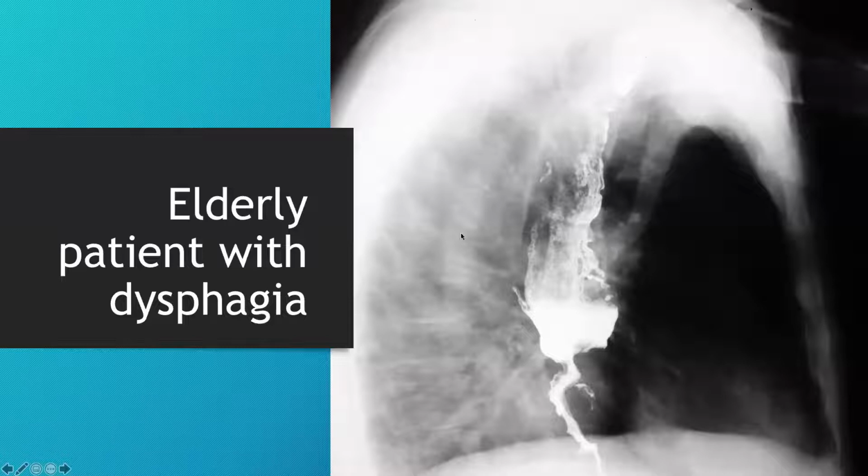So in this elderly patient with dysphagia, so barium swallow, you can see this dilated, ragged looking esophagus, and you're seeing what we call a rat tail with shouldering. So this is classic for carcinoma of the esophagus. So certainly now you have made this diagnosis on barium. You want to stage the patient, you want to look at local involvement as well as potential for distal involvement. You'd move on then to CT and then probably other modalities depending on what you find at CT.